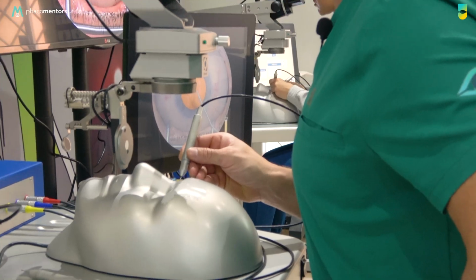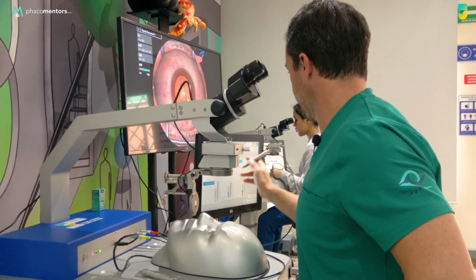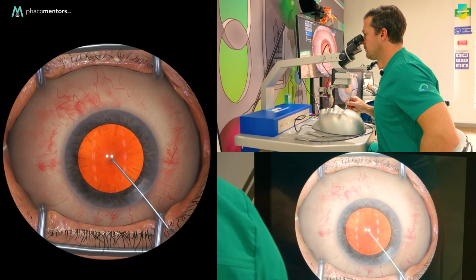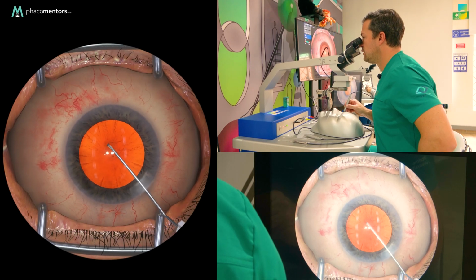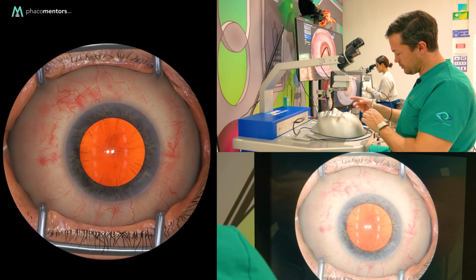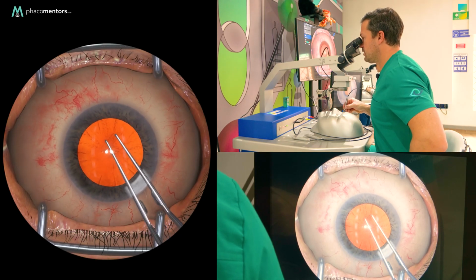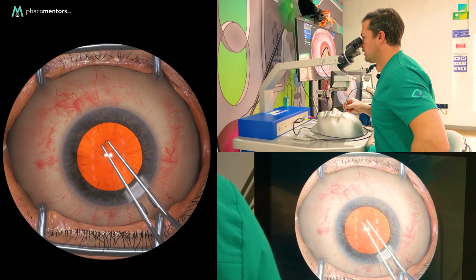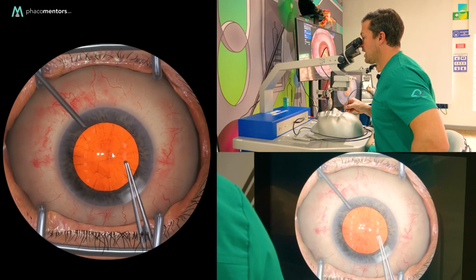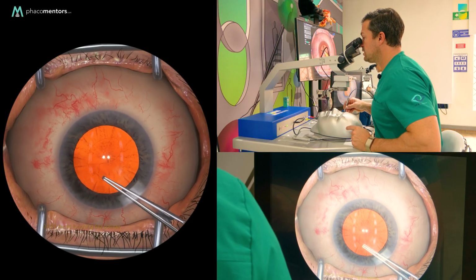We're going to inject viscoelastic, okay? Then we're going to create the first flap with a small cystotome. We enter laterally. We create that first flap, okay? And then look how I'm going to grab also the forceps. Remember, fixation point, 3 fingernails on the forehead of the patient. I enter laterally, frontal, then I'm going to grab it, then I'm going to control that capsulorhexis, okay? But what I want you to understand is how I'm floating through the incision and how I'm pivoting. My correct hand position allows me to pivot and to float.